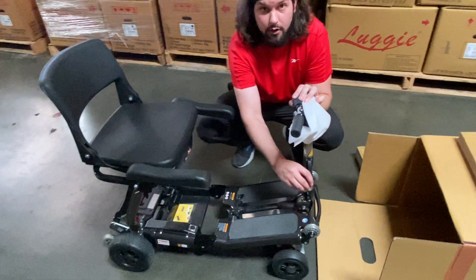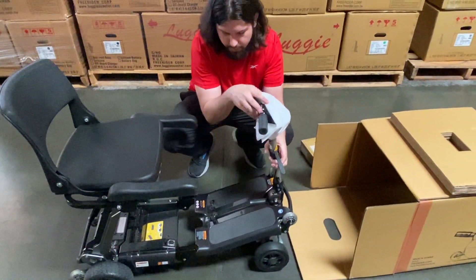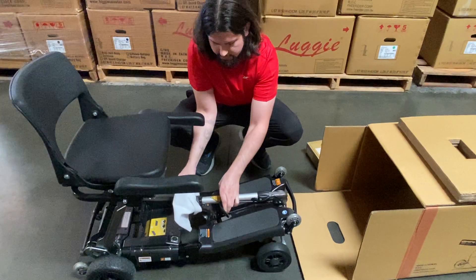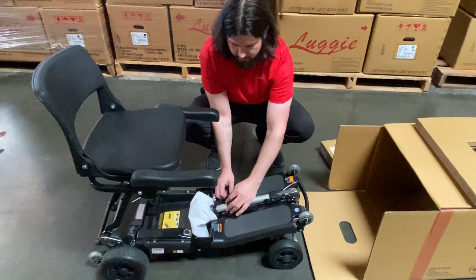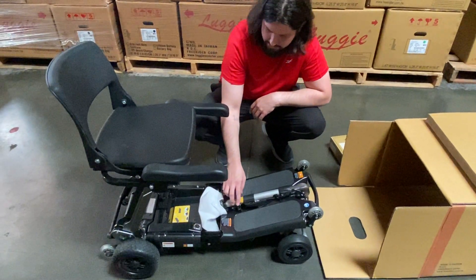Next, pull all the way out on your trigger bracket. Bring your tiller all the way down into your tiller locking clamp. Close your tiller locking clamp.